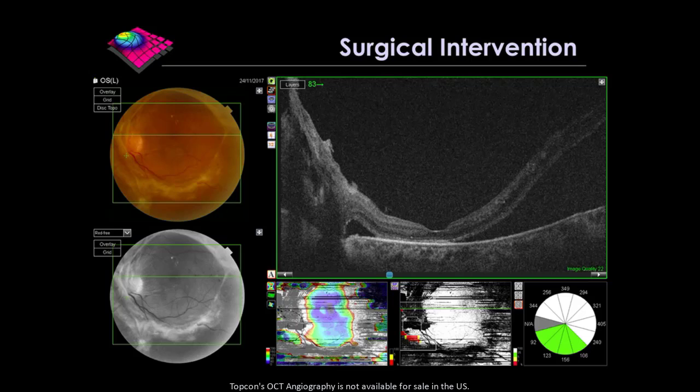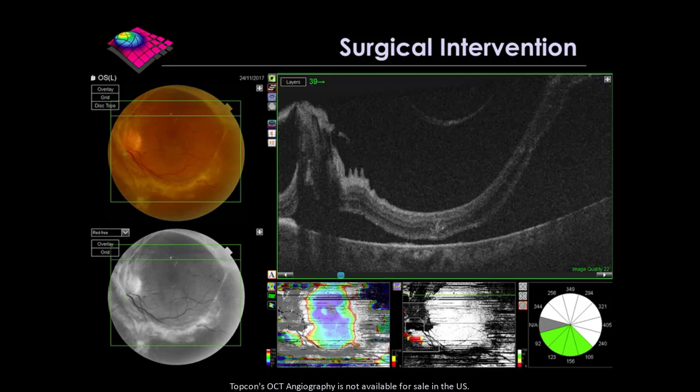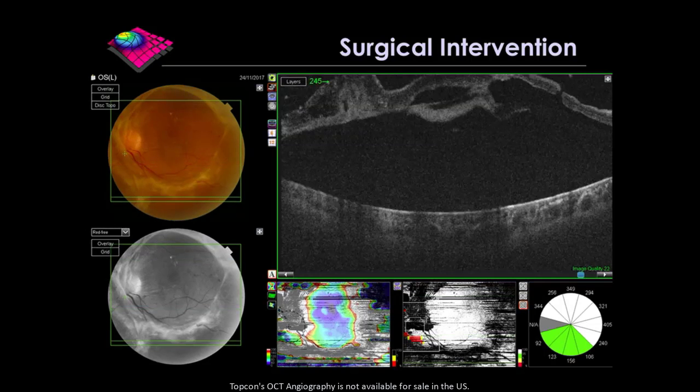But in fact, if you pay attention and you look at the wide field OCT and you look at different cuts and compare it to the way it was before, you're seeing the whole retina is being pulled off. And we can take different cuts. And so what was before more of a schisis type picture is now clearly frank retinal detachment in these cases. You can see on this cut down below, and then I think there's one more. Look, it's way off. And our vision is still 6/9.